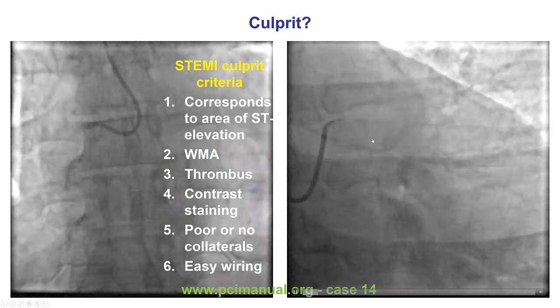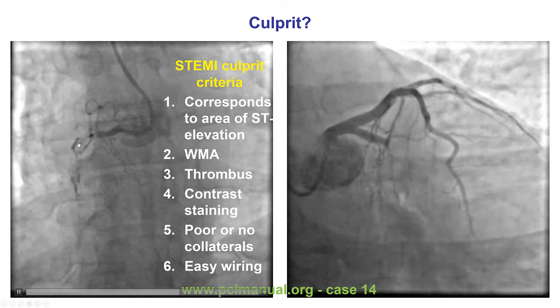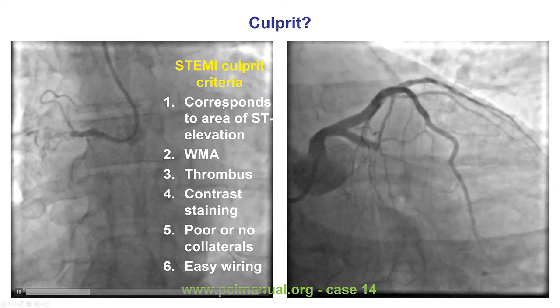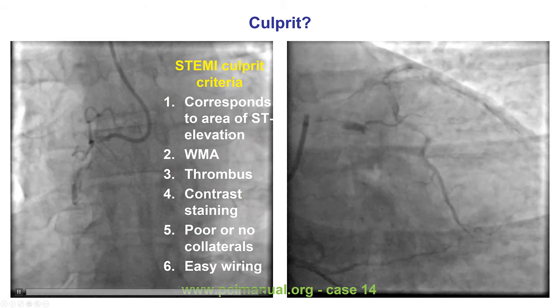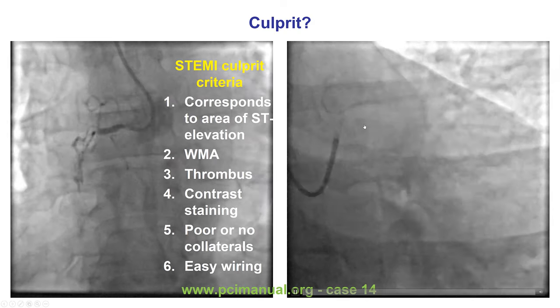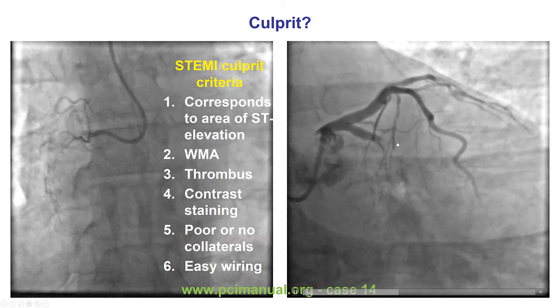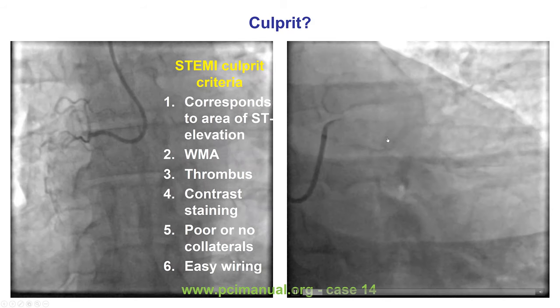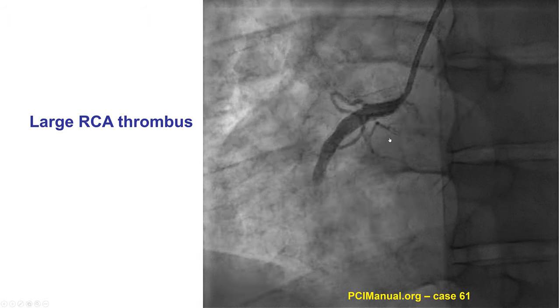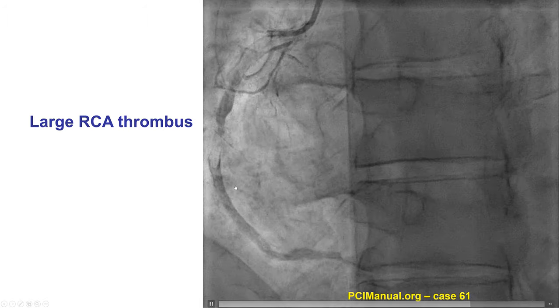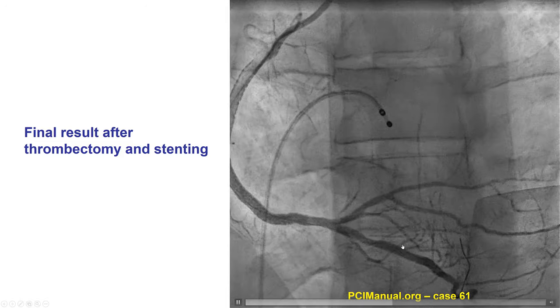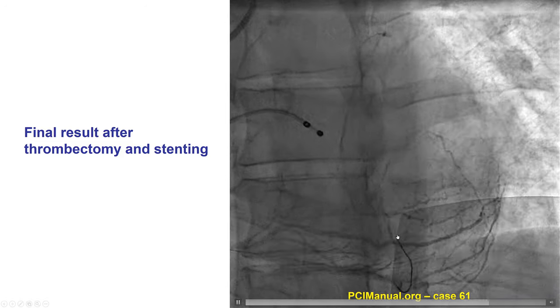Sometimes differentiating between thrombus and chronic complete occlusion can be challenging. Several criteria can be used: correspondence to areas of ST elevation, wall-motion abnormalities, filling defects suggestive of thrombus, and contrast retention within the thrombus. In the case shown earlier, a large filling defect representing thrombus was successfully aspirated, followed by stenting and restoration of TIMI 3 flow in the right coronary artery.